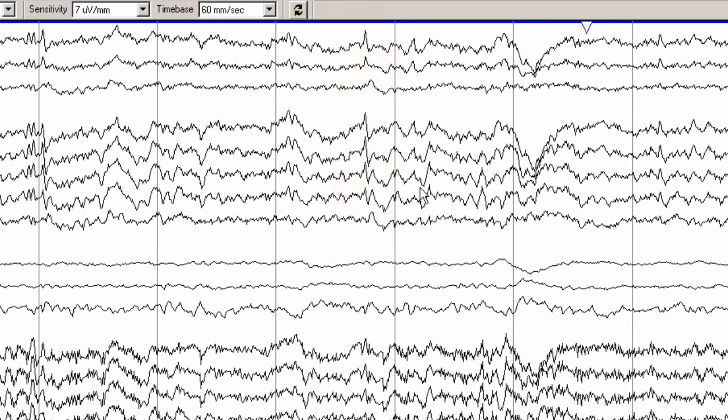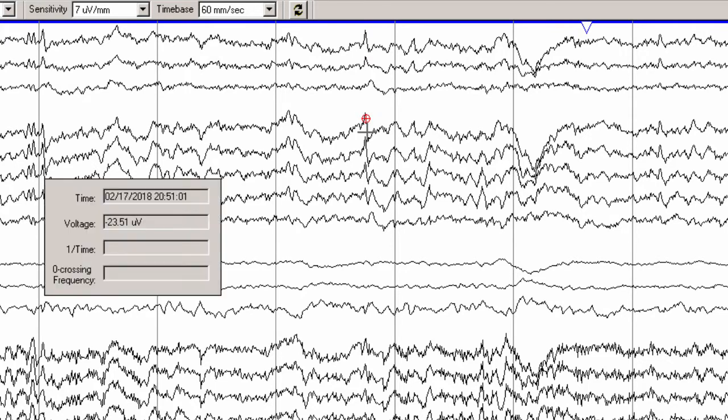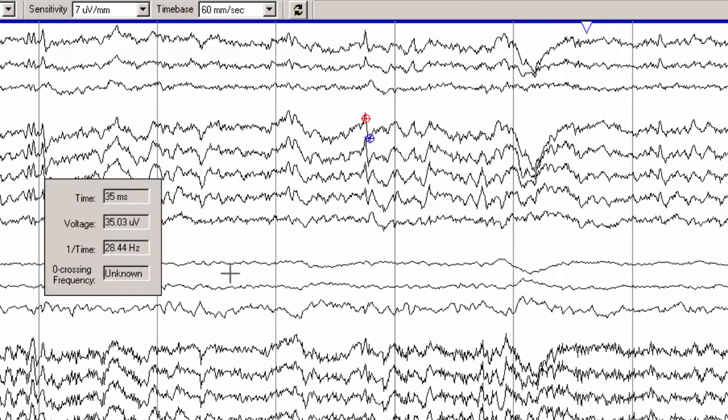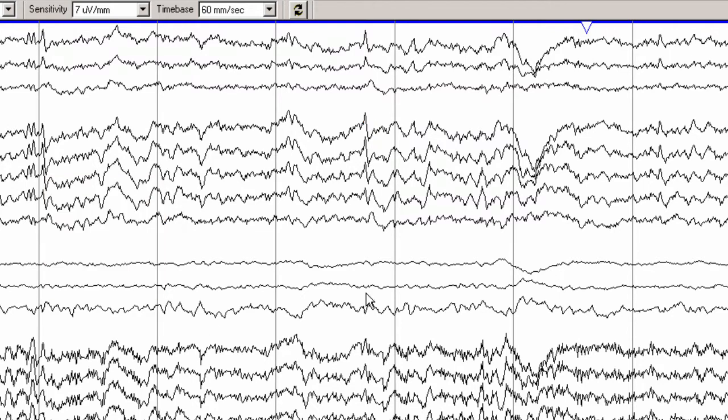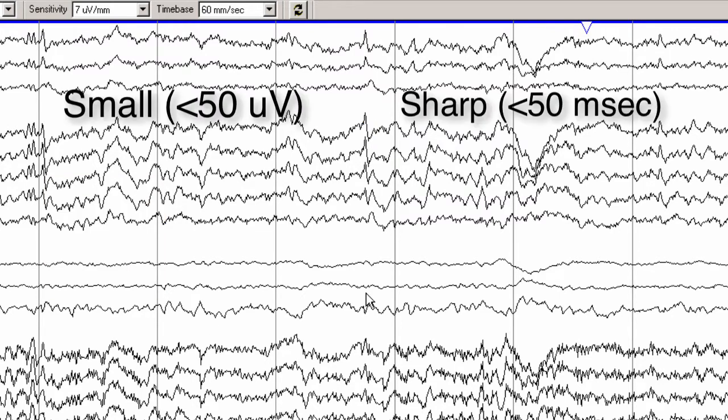Again we can see that it is very sharply contoured with a very low voltage. If we measure this carefully from peak to trough, we can see that it is about 35 microvolts and lasts 35 milliseconds, which is very short duration. This is a small sharp spike.